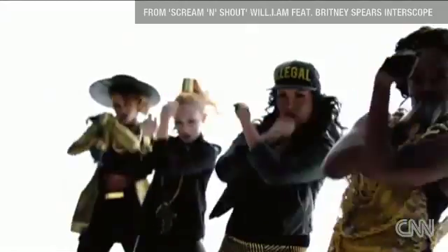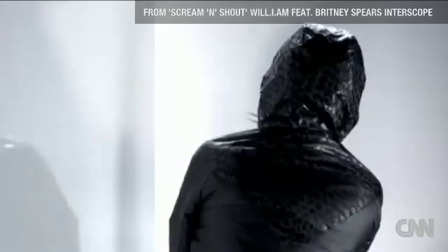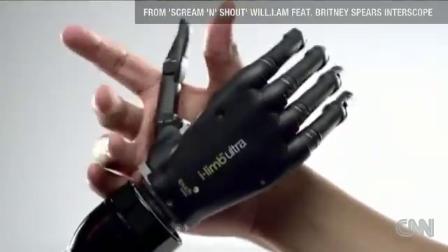It's so seductive, so cool, it features in the latest Will.I.Am and Britney Spears music video.